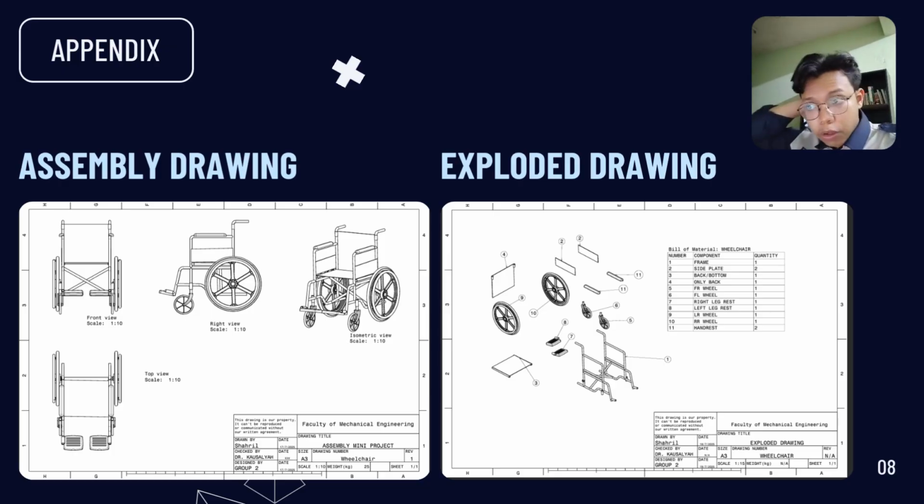And finally, moving on to our assembly drawing and also the bill of material drawing. The assembly drawing is basically just assembling all the parts into one drawing, which in ours is the wheelchair. And also we have the drawing of our bill of material. So for each part, we have the quantity and also the name of it.